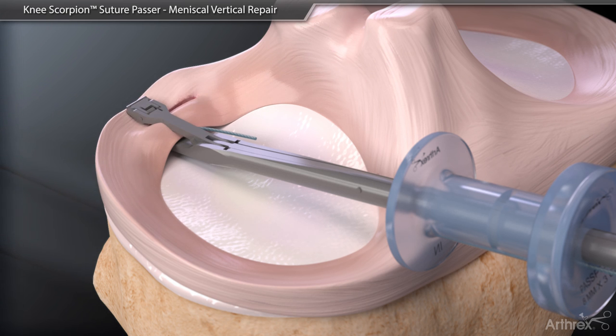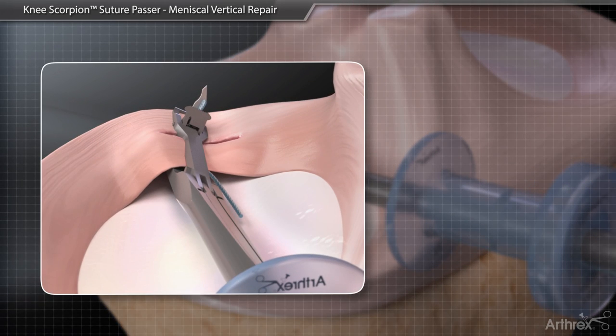Gently close the jaws to secure the tissue and then advance the scorpion needle to pass the suture through the tissue. The suture will be captured in the top jaw. Passing suture in tight areas may require slight rotation of the Knee Scorpion to allow the needle to exit into the intercondylar notch to avoid hitting the articular surface of the condyle.